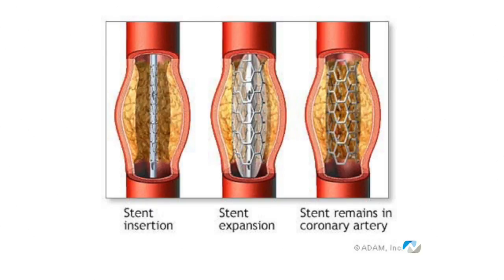We have different kinds of stents. Some people, we only use a balloon. Some people, a balloon and a stent. It depends on the anatomy. It depends on the location. Most of us can get away with one stent. Some of us may require multiple stents. And when we do the cardiac catheterization, we may have only one blockage in one artery that's causing the problem. We may have multiple blockages. And a lot of times, we address the one that got us in trouble on that day, and we let the rest wait until a subsequent time. It could be during that same admission or you could be brought back to the hospital to have it done.